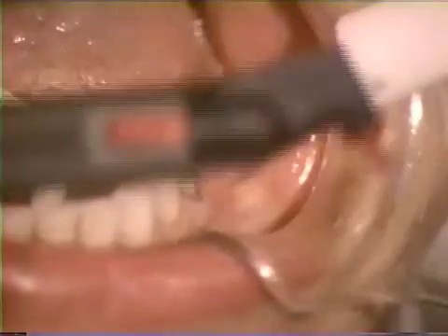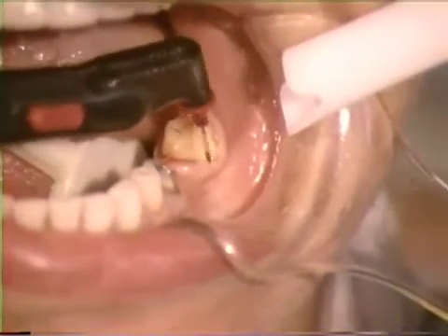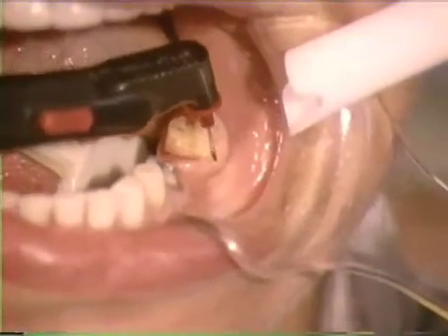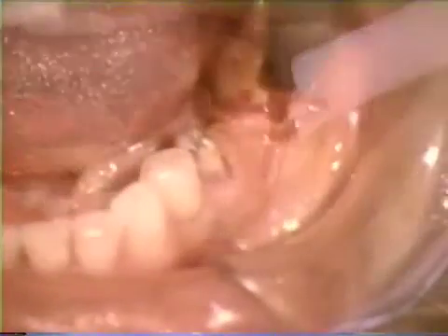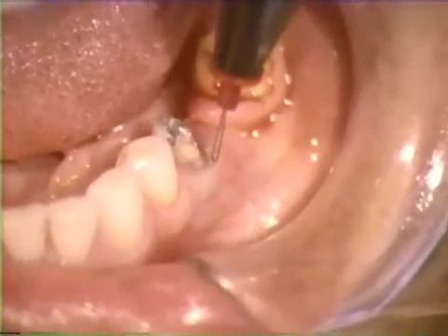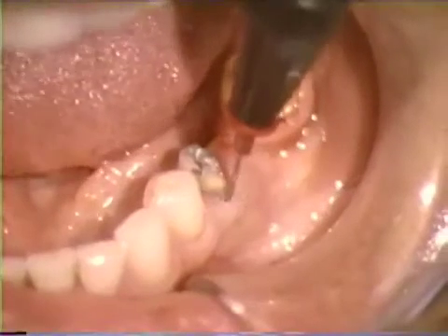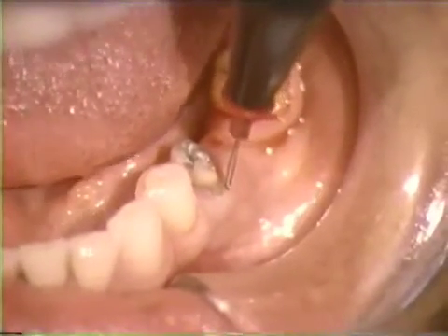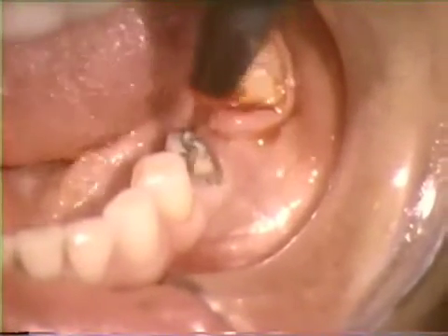The first cut is made using a fine wire loop angled outward from the tooth's vertical axis. Note that tissue debris must be frequently removed from the tip using gauze or suction. During electrosurgical procedures, the electro-tip acts as a probe most of the time. The area to be cut is probed first and then cut using fast-cutting movements. Practice strokes over the site are helpful prior to activating the cutting tip.